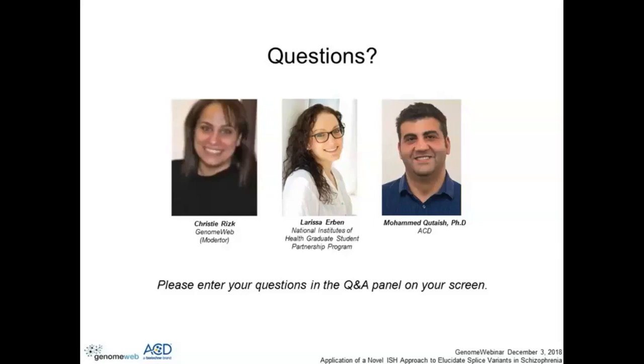Can you speak to the time frame of the experiment, imaging and quantification, and how long does it take per sample? So that's, of course, highly variable, depends how big the area of interest is that you want to analyze. In general, obviously, RNAscope is done in a day, and then the next day you would go to image. The imaging through the Z-stack and tiling at 63x or 40x is a little bit time intensive, so it might take about 30 minutes per image.